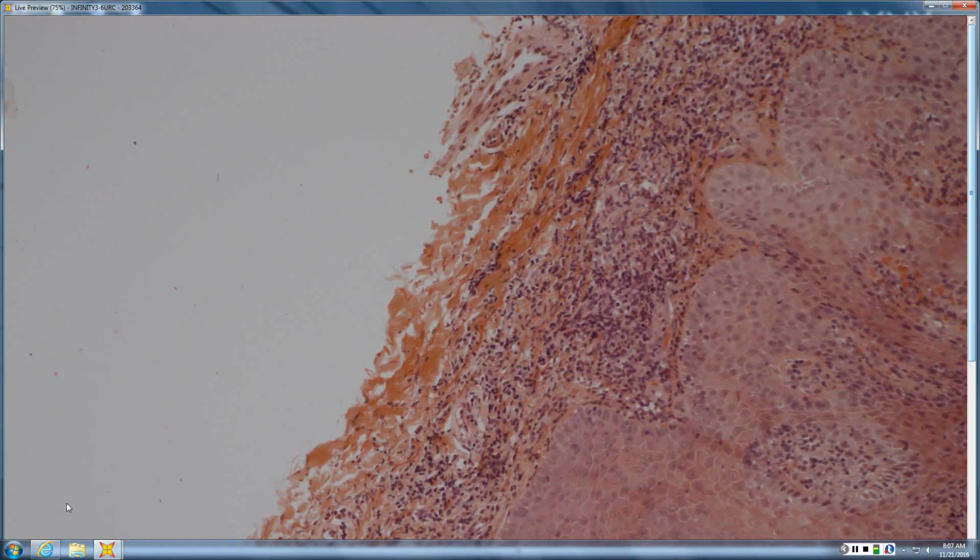Remember, it can be any mix, though. Syphilis with fewer features has effacement of the rete predominantly rather than long, slender, sexy. And so in those cases, endothelial swelling, neutrophils in the horn, busy dermis, plasma cells if present, all of those things become important. The paper that was just in the last Journal of Cutaneous Pathology from Cleveland Clinic looked at HIV patients with syphilis.